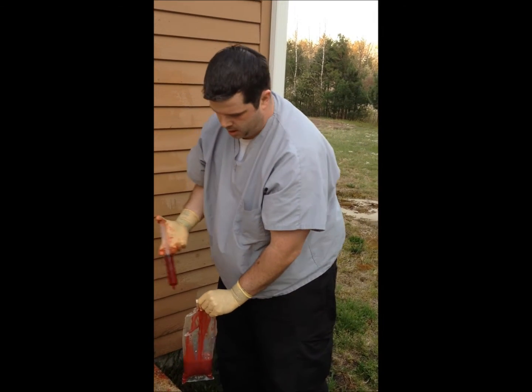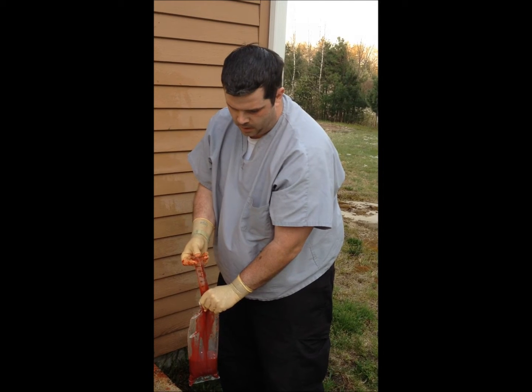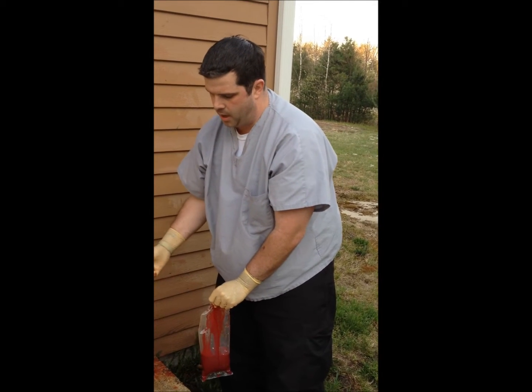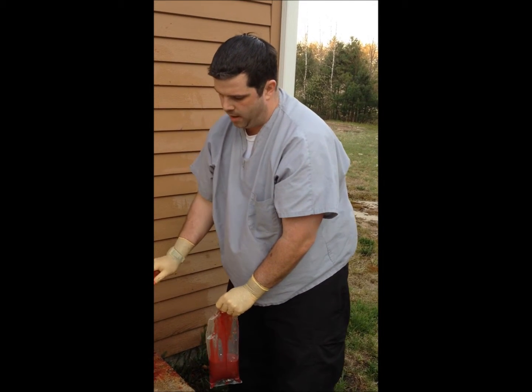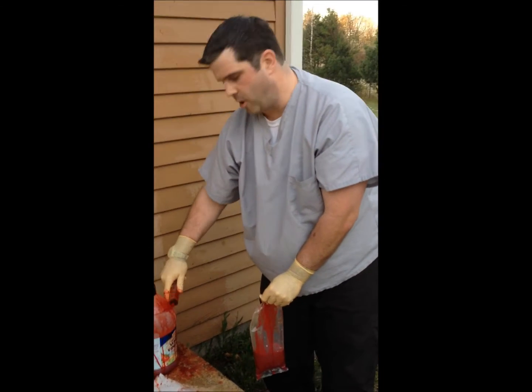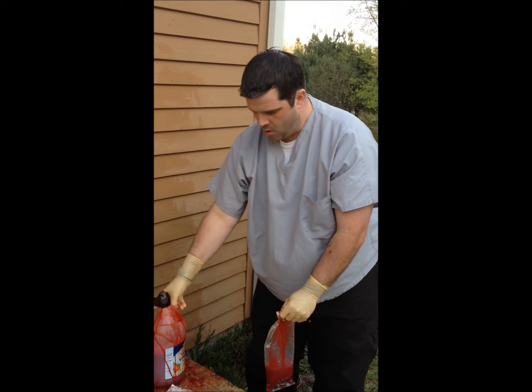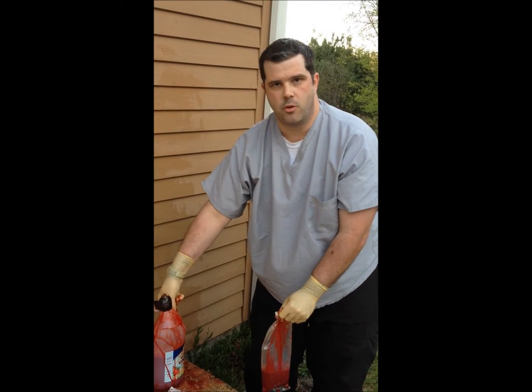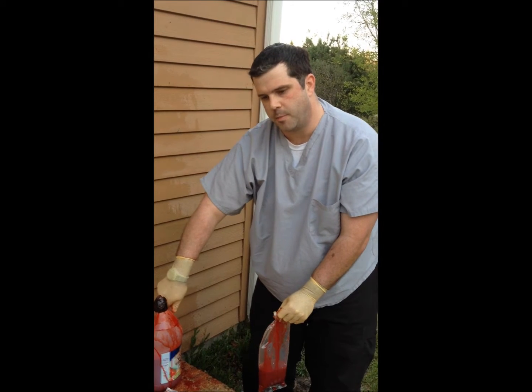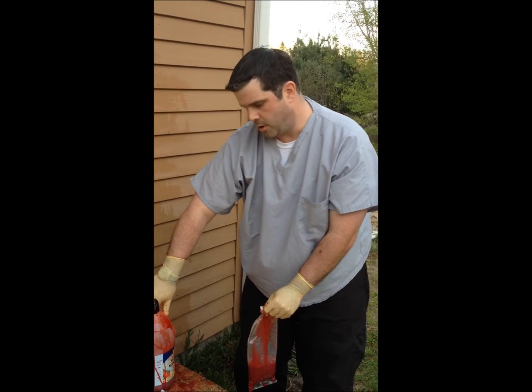What we're going to do is take pig's blood, attach it to a pressure bag, crank that pressure bag up to physiologic arterial pressure, and run some IV needles into the pig tissue that has the gunshot wounds inflicted to it, to simulate arterial bleeds.